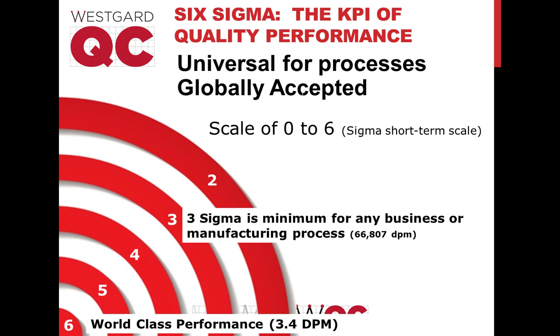Measuring Six Sigma, we find when we've actually talked with labs that do Six Sigma, they're looking maybe at once every 3 months or once a month. And the only reason that they're doing it once a month that frequently is typically most labs are doing a QC review at the end of a month. And at the same time you're doing a QC review, you have all the same information that is going to feed into your Sigma metric. So if you're looking at the QC events, you have the data. You can also look at an update of the Sigma metric.